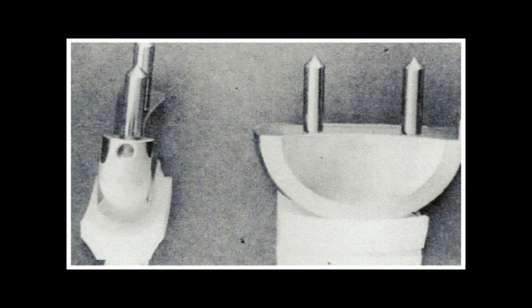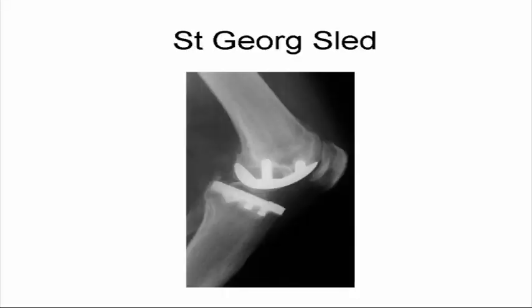Gunston extended Mackintosh's ideas by putting femoral metal runners bearing on tibial polythene troughs. Acrylic cement was necessary to fix the implants to bone. The disadvantage was that the tracking was constrained. This meant that no allowance was made for rotation, with the result that premature loosening or wear occurred. The problem of constraint was overcome by unicompartmental prostheses, such as the St.